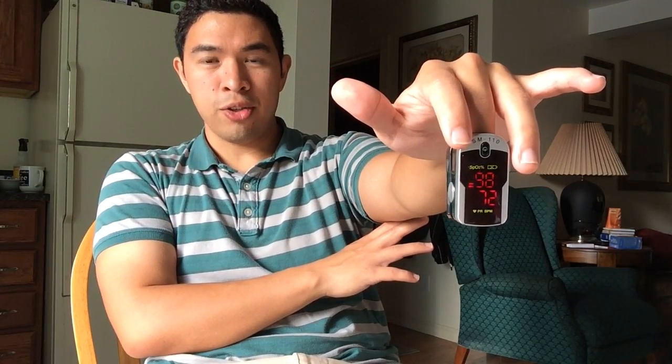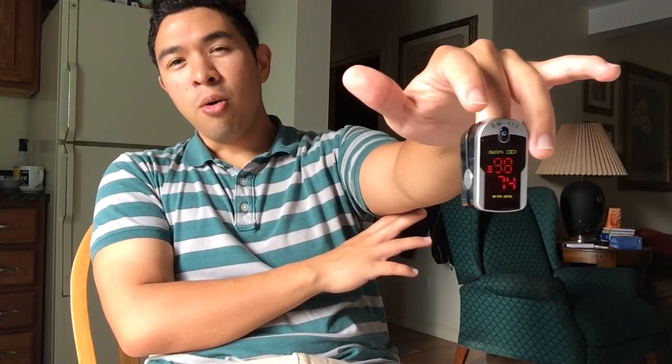Most finger units come in at about the same quality. I've had the opportunity to compare this to a whole number of different finger units and they're all about as accurate, being about one or two points off on the oxygen saturation and maybe five or so off on the heart rate.